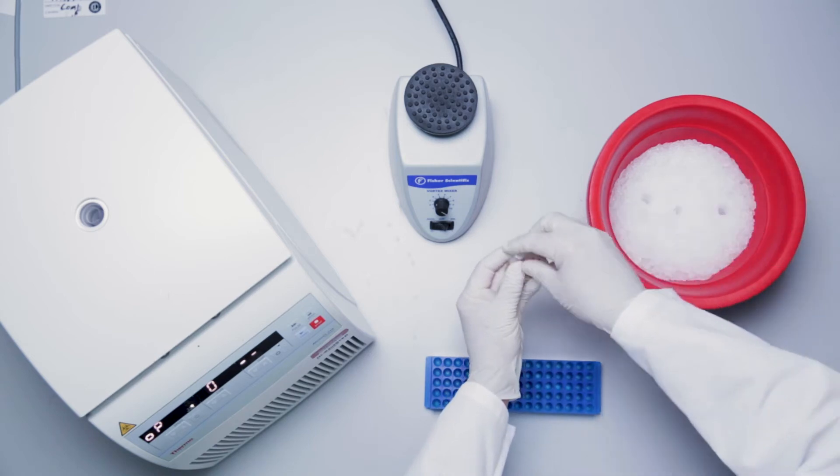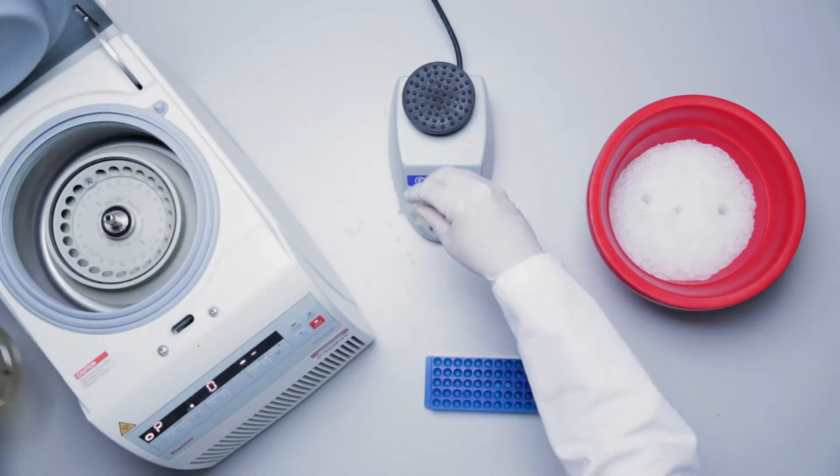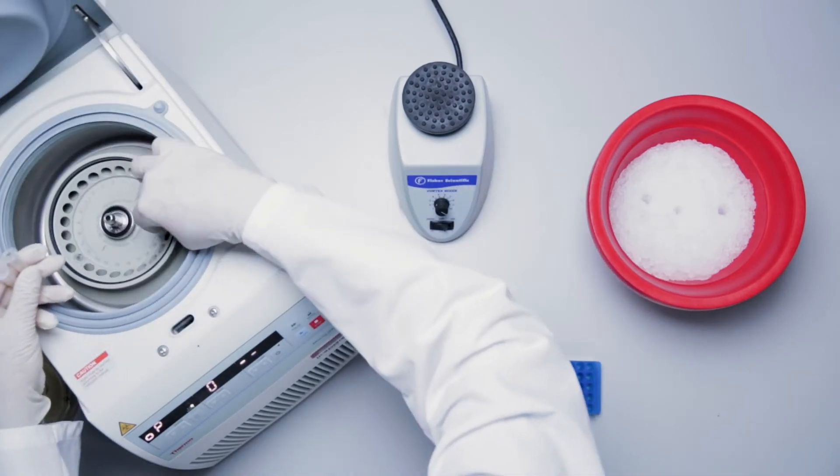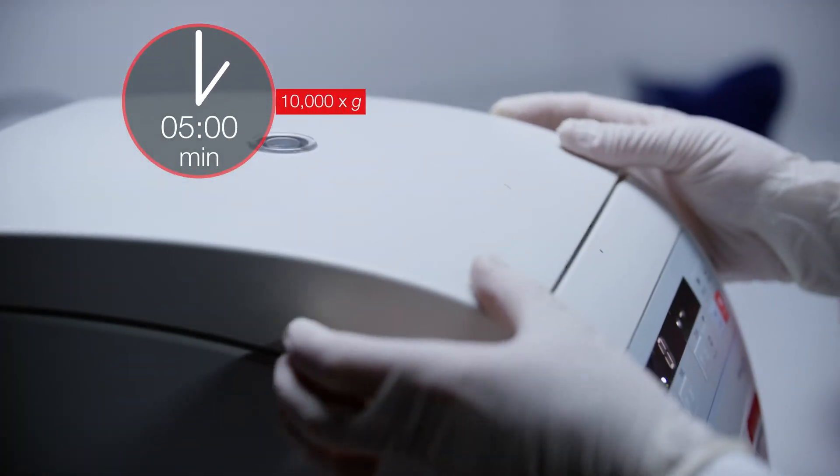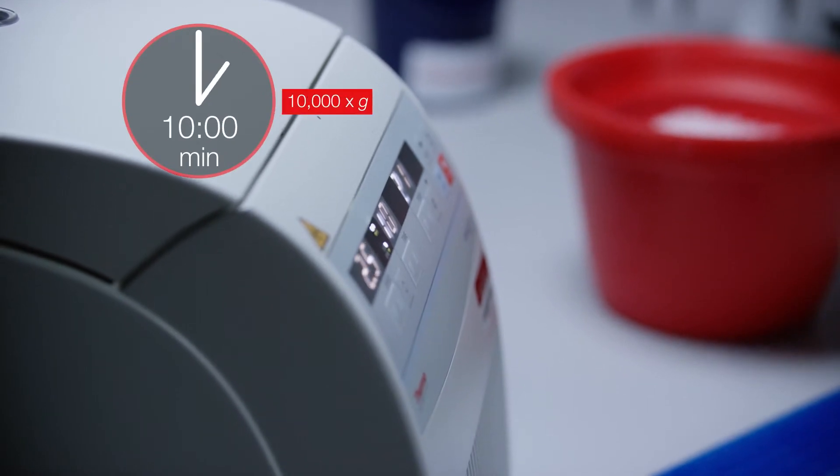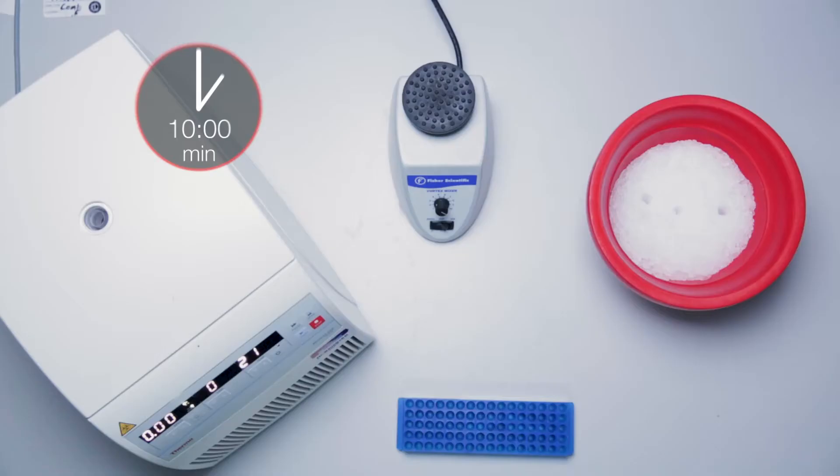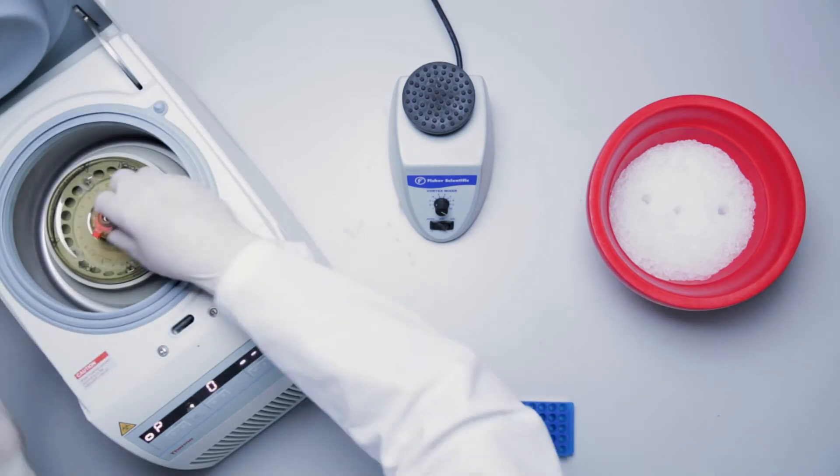Mix well by vortexing. Centrifuge at 10,000 g for 5 minutes to remove particulates, or for 10 minutes if samples are high in lipid content. Transfer the contents to a new tube. Avoid multiple freeze-thaw cycles.